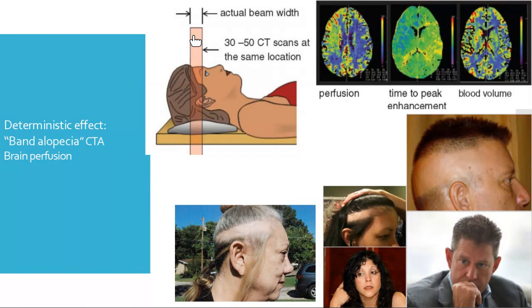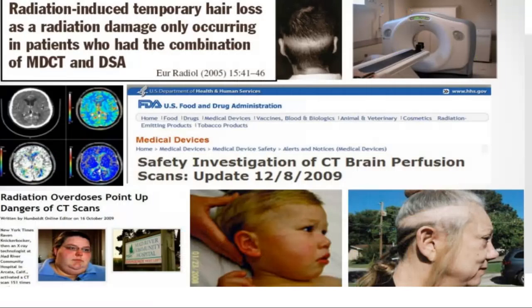Although this effect was reduced or eliminated for almost 100 years, this effect for patients was reduced until 1910, I think. After that, no effects except in radiation therapy. But nowadays, because we have very powerful CT machines, powerful X-ray machines, we now have this kind of effect. We have to deal with it very wisely.